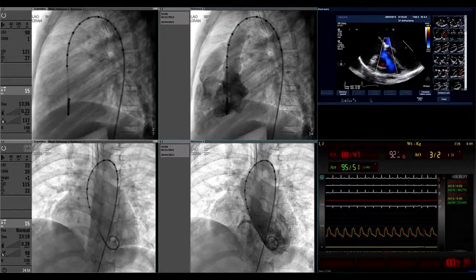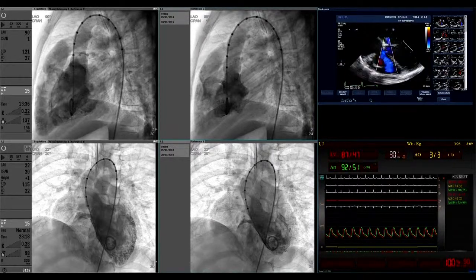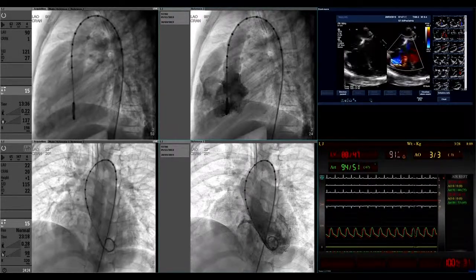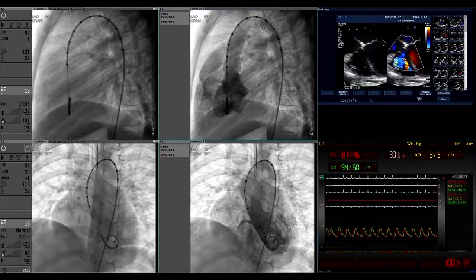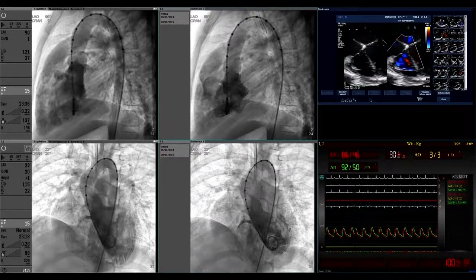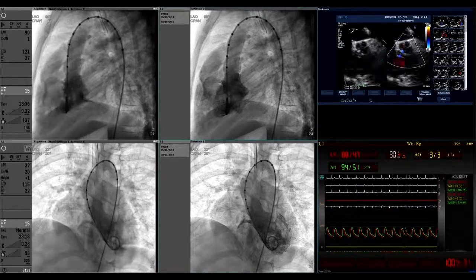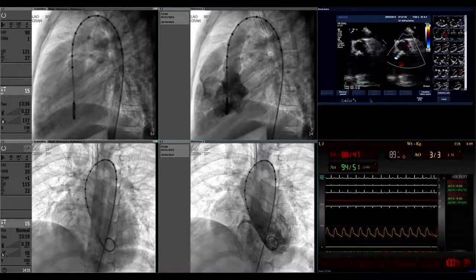Okay, let me ask the panelists here. Carlos, how would you approach this VSD? A restrictive, maybe 3.5 to 4 millimeter, defect which is well separated from the aortic valve. With LA and LV dilatation, it warrants a closure. So what are your device options? How will you approach it, antegrade, retrograde?